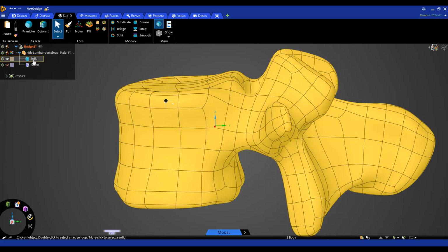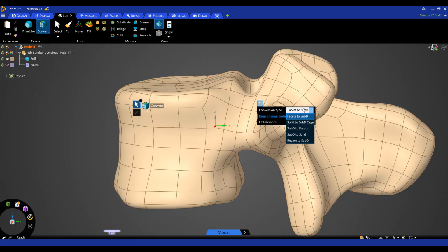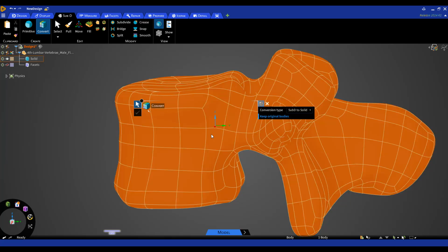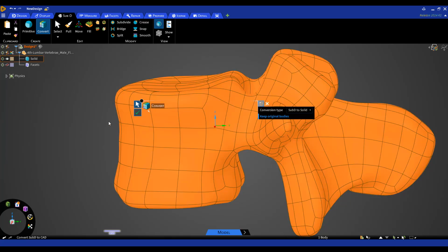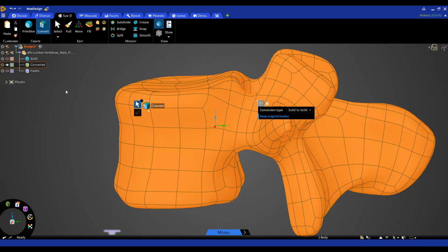We can convert this model. We can convert this one from SubD to solid. So let's go ahead and do that. We also keep the original model. So now I have three models. I have a facet geometry, the SubD, as well as a solid model. Okay, converted solid model, SubD, and faceted geometry.